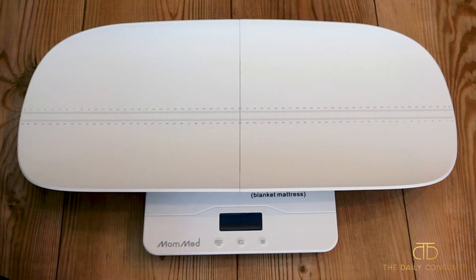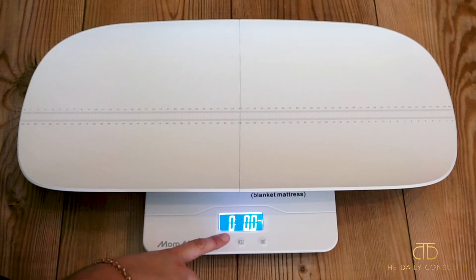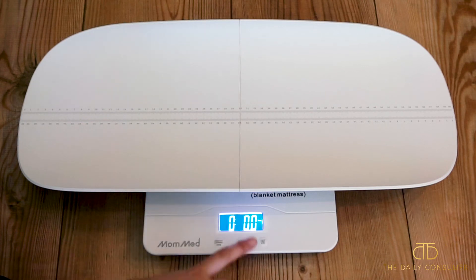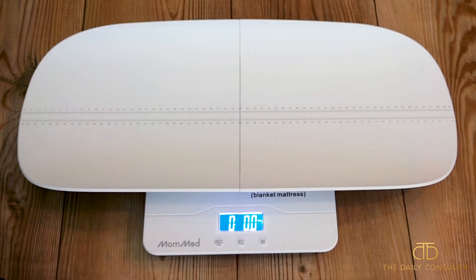Once it's already connected, you can go ahead and turn it on and off. I've just turned it on and you can see here on the screen it's giving you the exact measurement that it is weighing right now, which is nothing. You can see your unit — right now I have it on pounds and ounces, but you can press the unit button and it'll go to kilograms, ounces, just pounds, and then back to pounds and ounces.